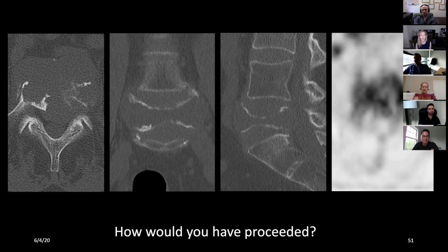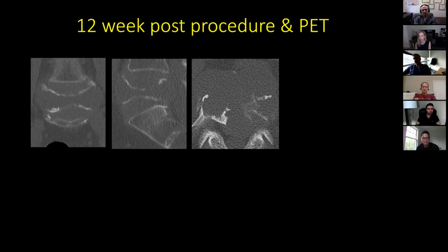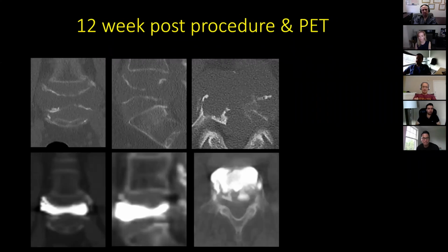Yeah. So it was punted on to me: can you do anything? I said okay, I'll try, and so it took us 2 sittings. We ablated this and then put cement in this, and this is what it looked like. And this is what it looked like post ablation and cementation.